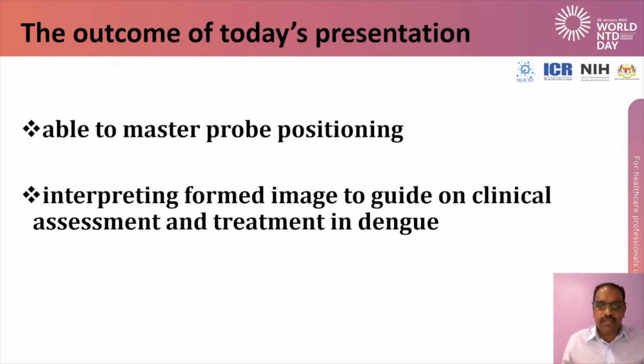As I know, here we have a mixed group of doctors who are listening to this CME. They might be a group of people who have no experience using ultrasound. Some might have some experience using ultrasound, and some never had proper guidance or teaching on using ultrasound. So in my presentation, I will start from the basics and we will move on to advanced ultrasound in dengue patients.